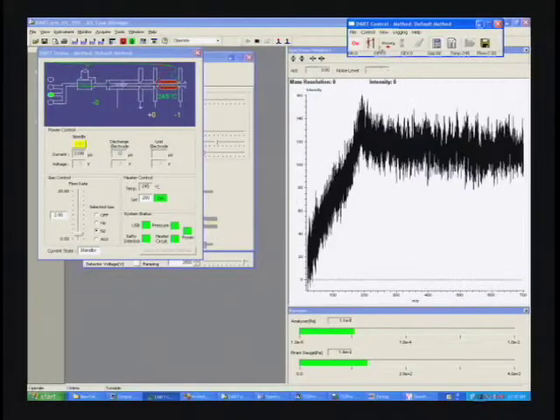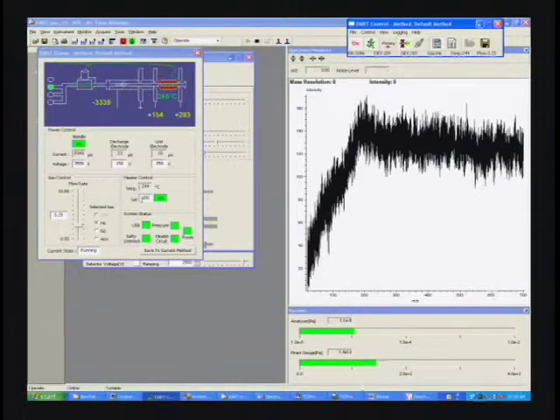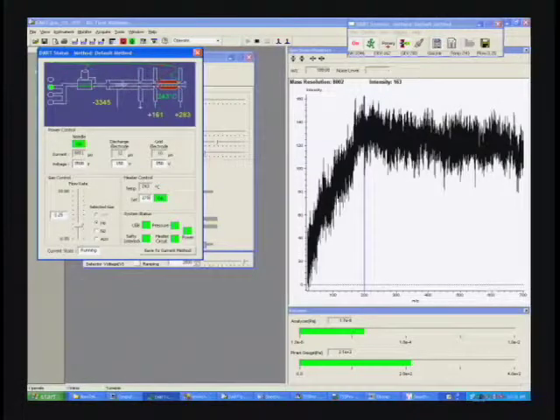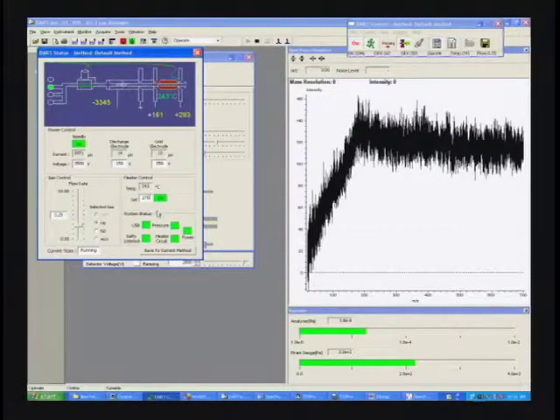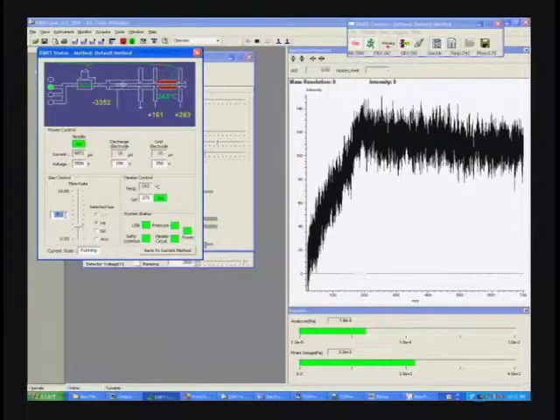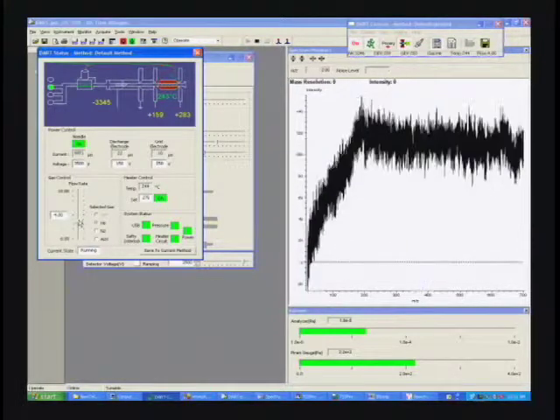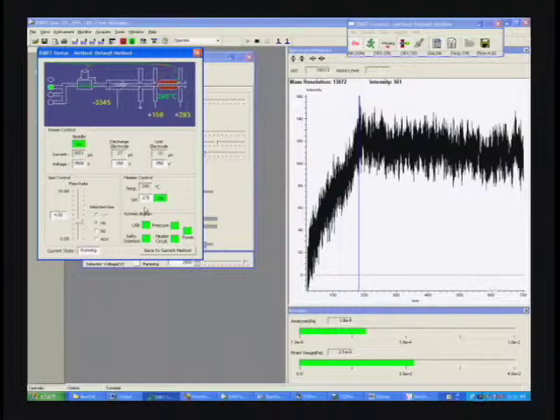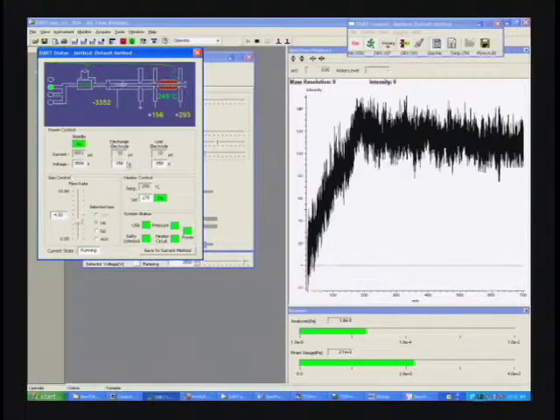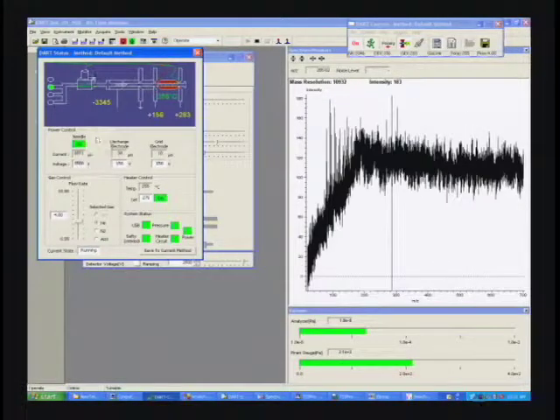But first thing we want to do is make sure we have our DART on and operating. We can set the DART gas temperature at the Department of Forensic Science. We use 275 degrees for our methods, and we use 4 liters a minute for the helium. So we'll wait for that to warm up, get stabilized in temperature. Our discharge voltage, our electrode, and the grid electrode are 150 and 250. That looks fine. Voltage at 3500, so we're good with that.